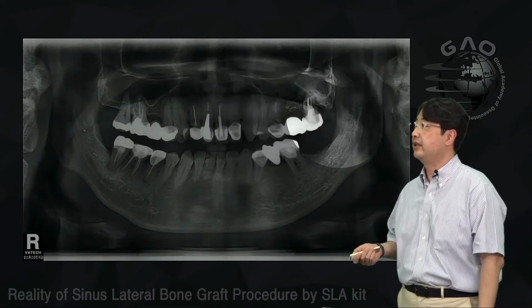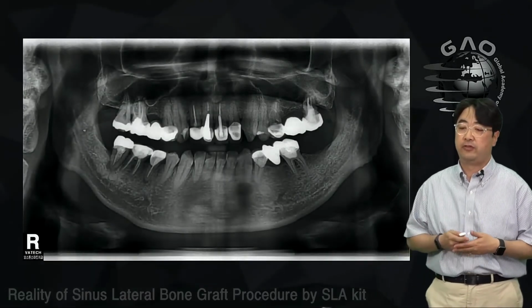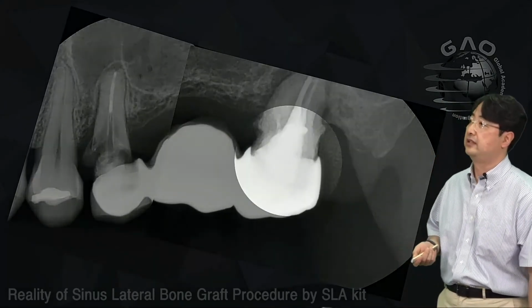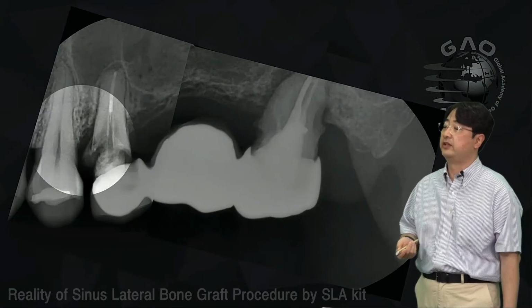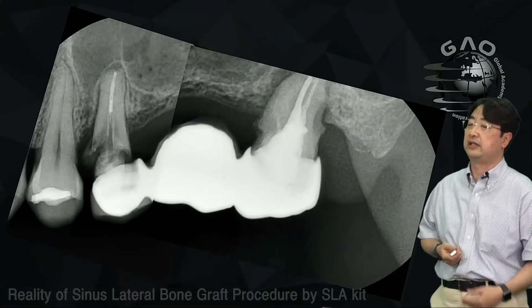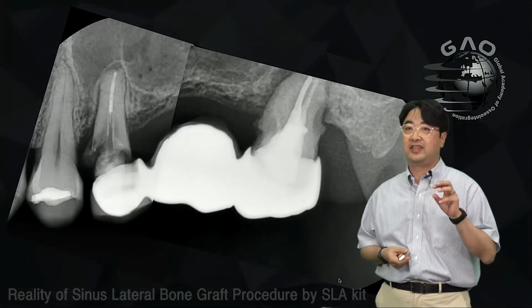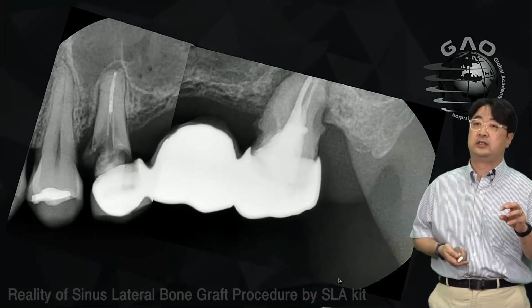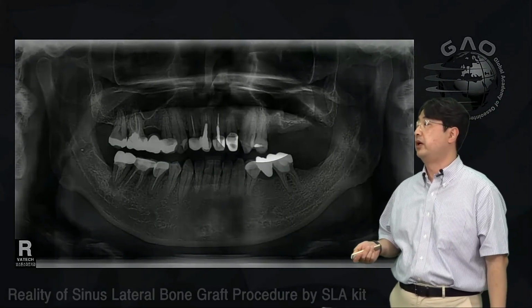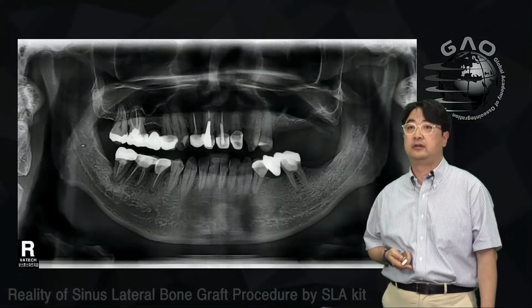Okay, so here, this patient needs extraction of number 25 and number 27, with a 3-unit fixed partial denture, because the patient had a fracture on number 25, and also you can see the periapical lesion on number 27. As you see here, this part has very thin cortical bone left, as it is pneumatized, right? Well, I removed teeth number 25 and number 27, right?